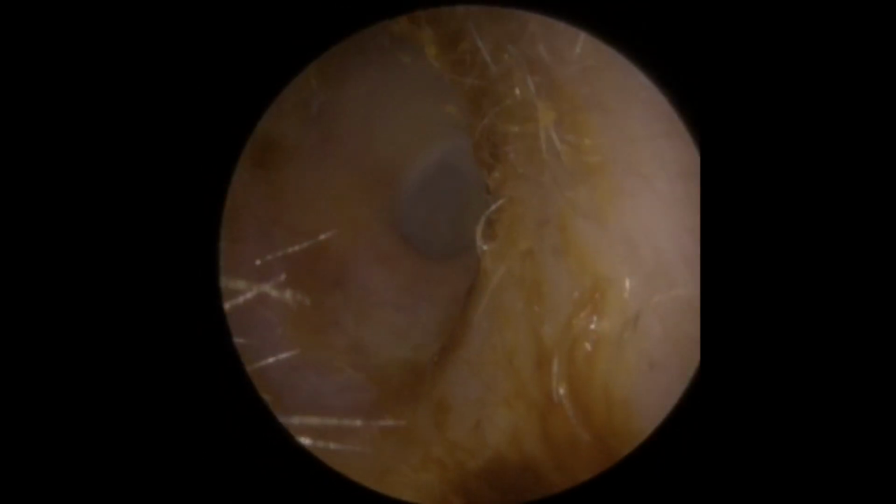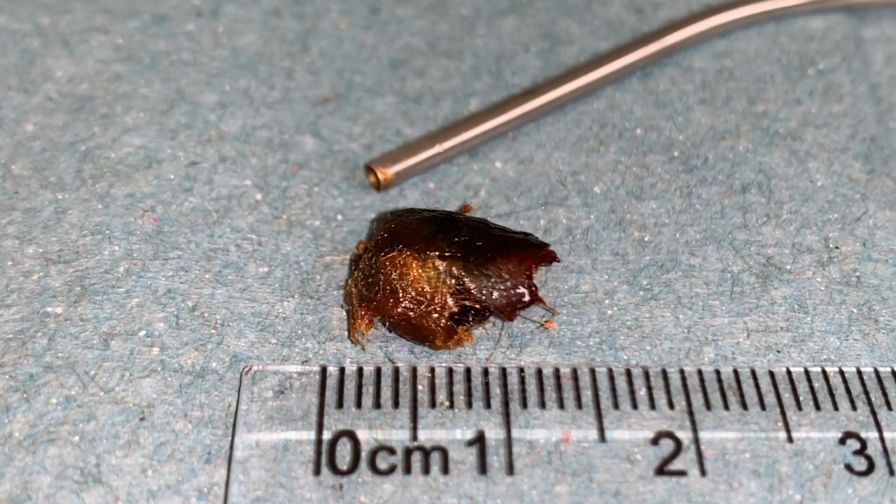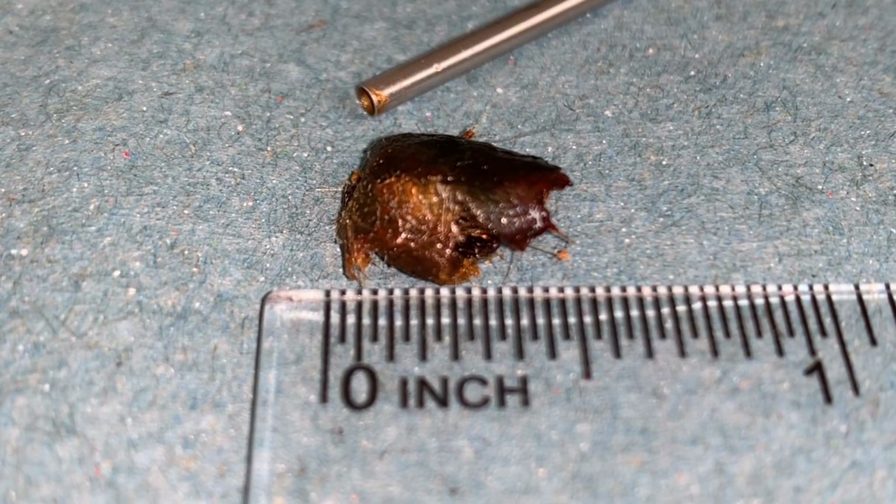But what we're doing here is just getting a grip on this wax and see how quickly now it's moving. Do you see how easy that is to come away compared to how it was a second ago? It just breaks that adhesion, breaks the stickiness, and allows it to come out a lot more easily. And there's the eardrum there looking nice and shiny. This is what we removed, so you can see this nugget of wax here. It's about a centimetre and a half, half an inch. There we go.